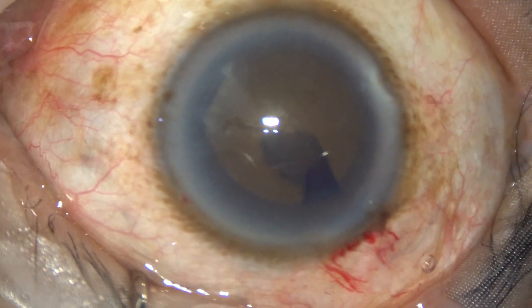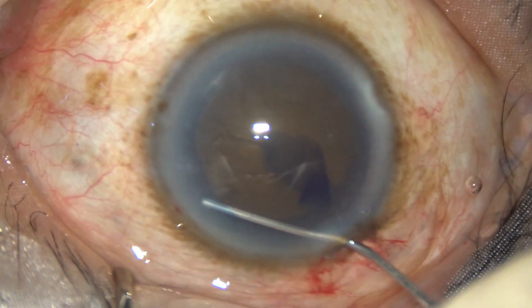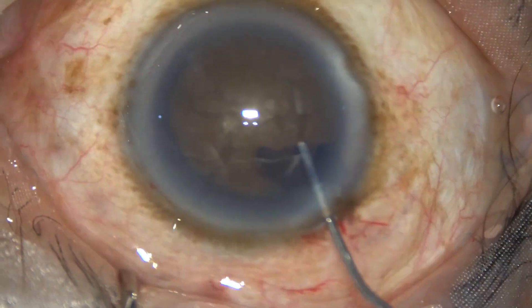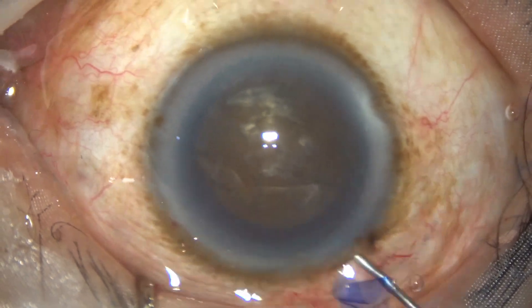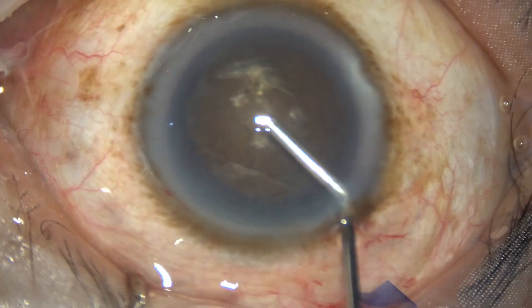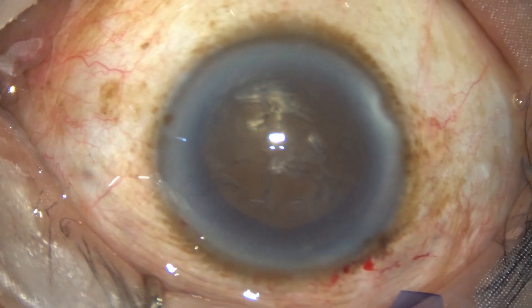Now hydrodissection is done very carefully. Small boluses of fluid are injected at multiple points. The nucleus is stabbed and then rotated. Now viscoelastic is injected again — this is two percent hydroxypropyl methylcellulose. We can also use chondroitin sulfate, and beneath the chondroitin sulfate we can use HPMC.